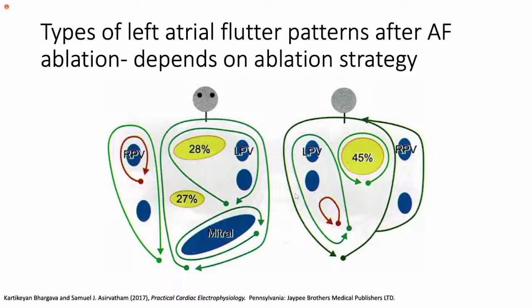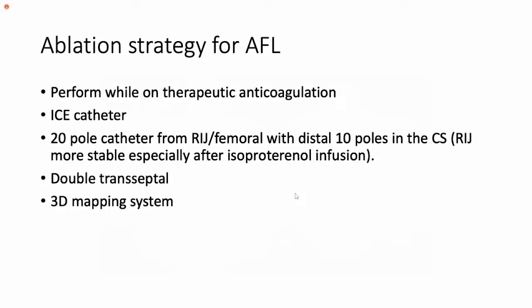This is from a paper from Sam Asirvatham, and a lot depends here on what strategy you're doing. If you do a strategy like Dr. Natali, you're not going to see this type of flutter in general. You'll see this more if you do lines or things like that.